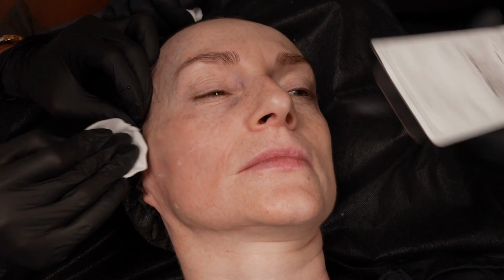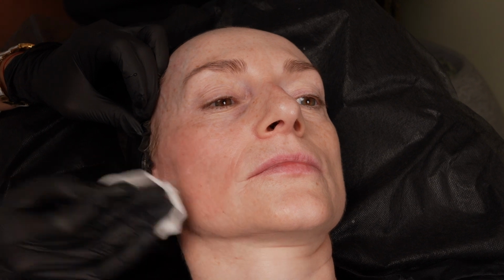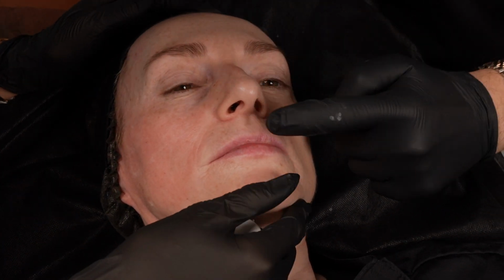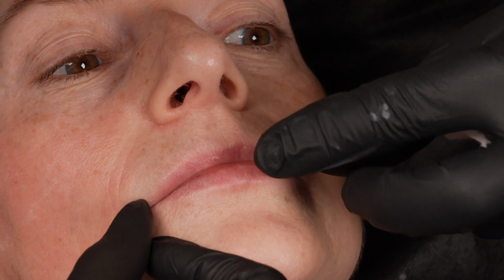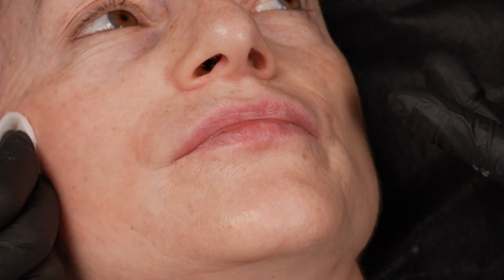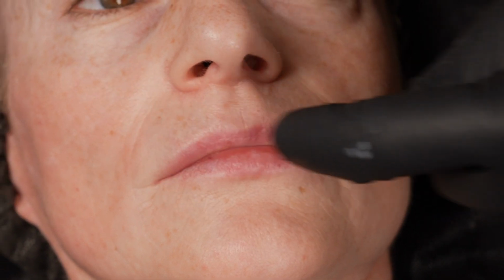Maybe after that we can also do just the contour for the lips. Okay, you like that? Look, there's no contour, not lip volume, because when you compare the face to lip, it's quite good. Yeah. Exactly. Чуть-чуть только вверх. But it's comparable, good lips, the volume when you compare with the face. But there is no contour. Just make contour. That's all.